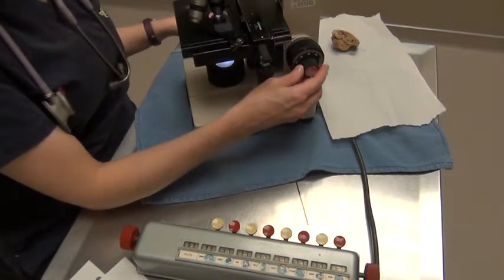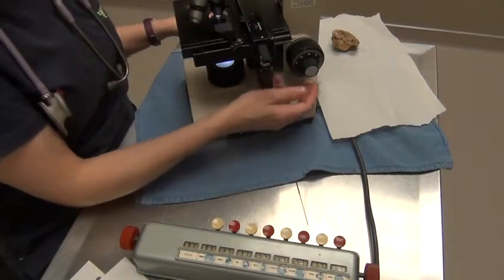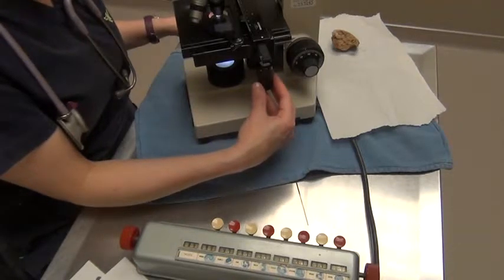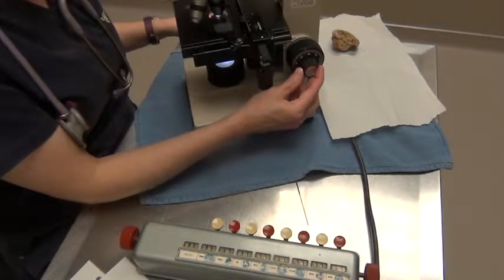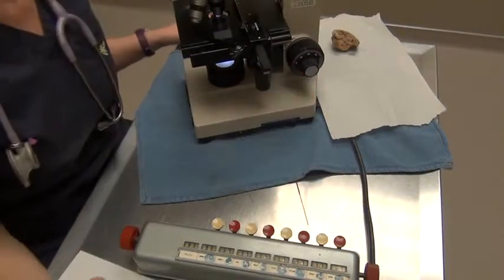I see some echinocytes, some burst cells, some crenated cells, and I even see some almost teardrop shaped red blood cells. And some of those abnormal shapes can be caused by the actual smearing on the slide. I do see some platelets, not a great deal, and I do have some clumping here and there.